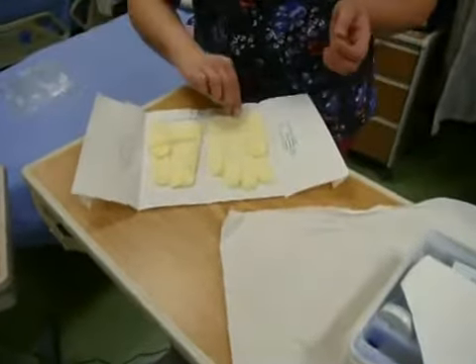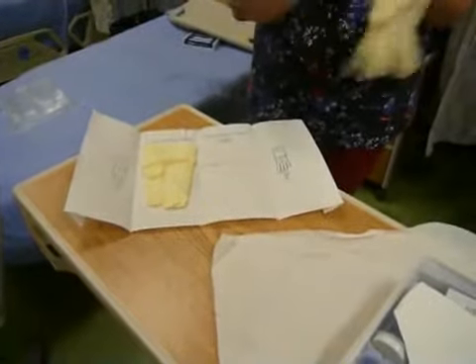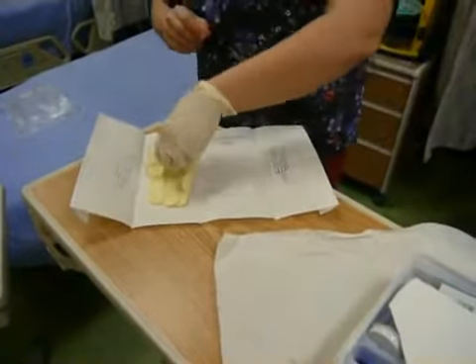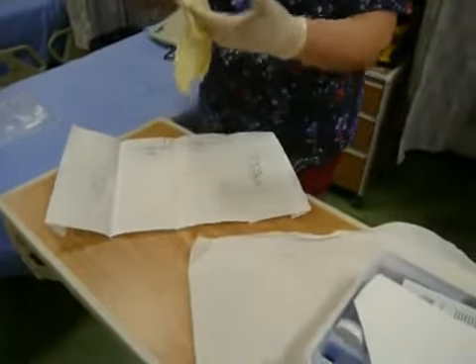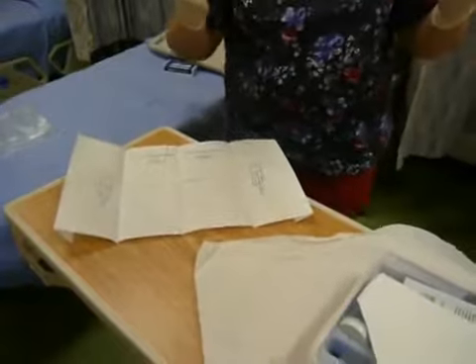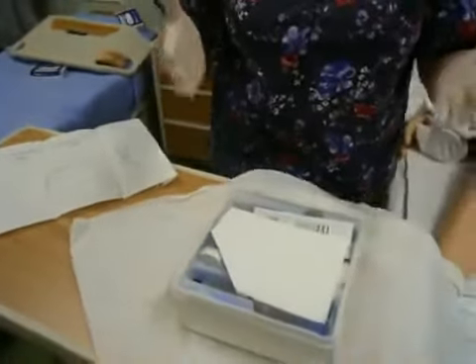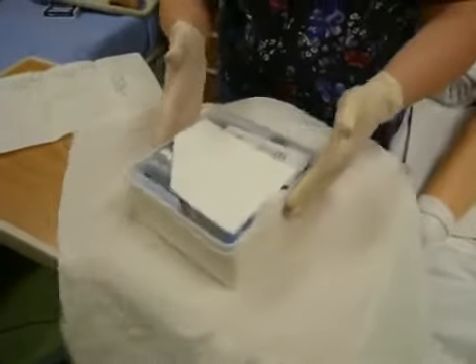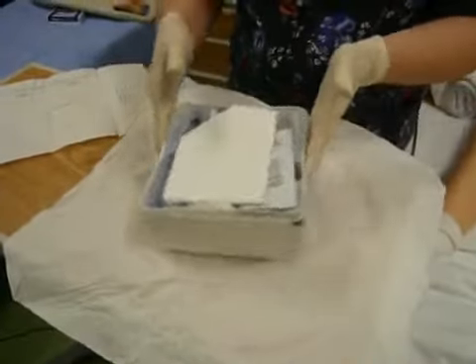Open them up. First glove I grab with the cuff, up and away, slide on, reposition the cuff once if I need to. Second glove, cuff, hitchhike my thumb, up and away, pull it on, no repositioning. If you have any questions about sterile gloving, please see the sterile gloving video that's on the YouTube website as well. Now, I'm going to finish getting my sterile field ready in here.